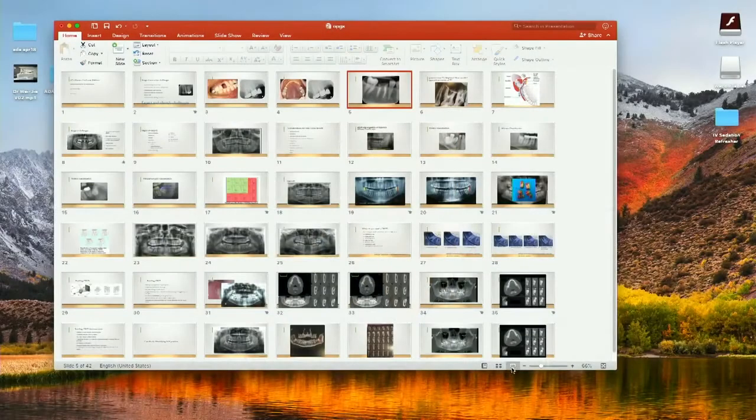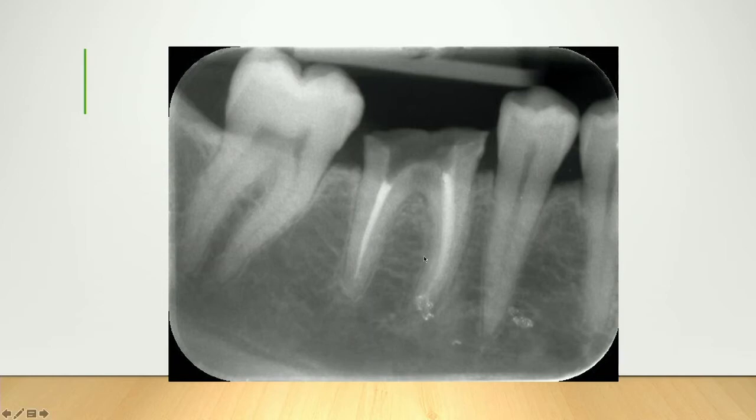So for instance, if we go back to this case where we had a root canal treated tooth, this is a fairly straightforward tooth to remove, but say we had lots and lots of difficulty, we sectioned, we tried to get it out and it just fractured, just couldn't get it out, then what I'd do is get a round burr and I basically bury the roots and drill it flat, and then just bury the root there.